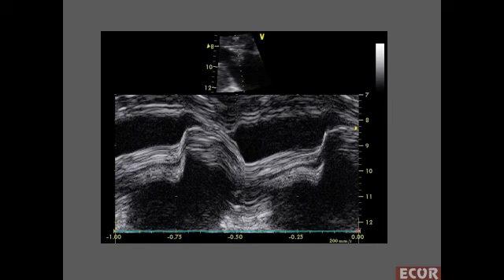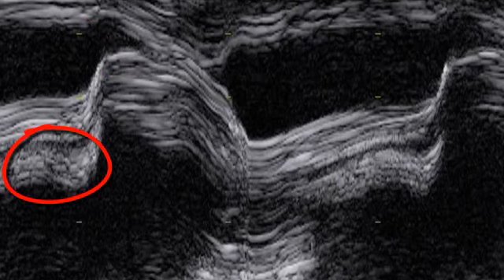One more case of heavily calcified mitral stenosis. But look here, there is also vegetation in this valve. In this location, you see an obvious aspect of calcification with clear-cut lines. But in the same valve, there are smudge and ragged torn paper signs of vegetations.